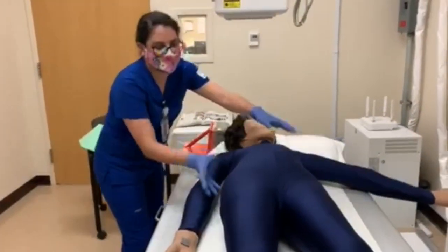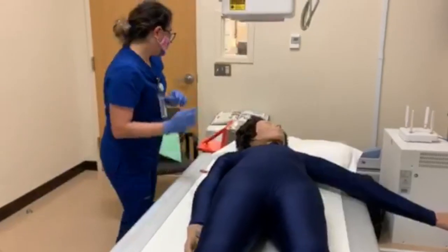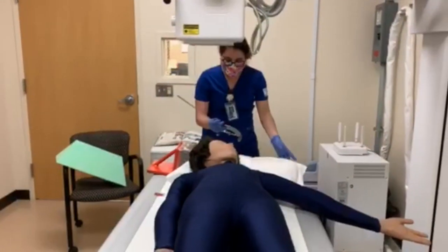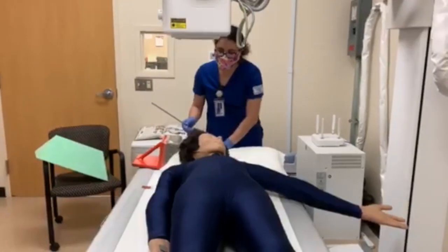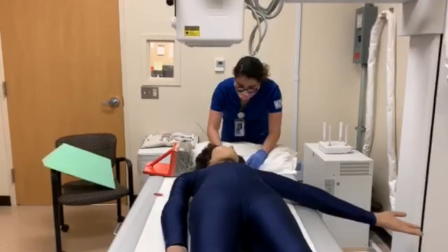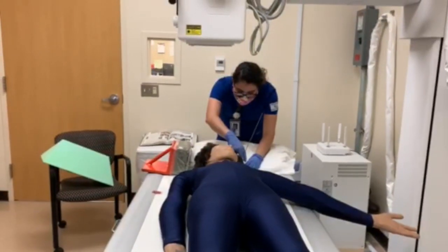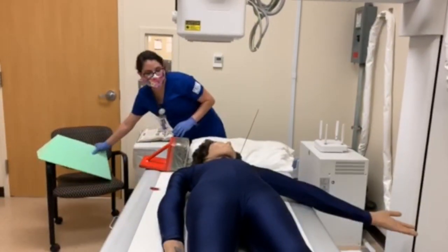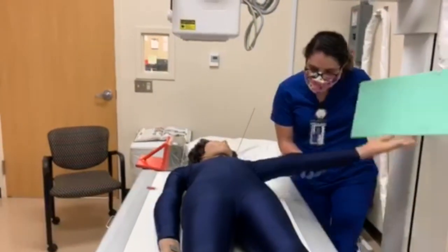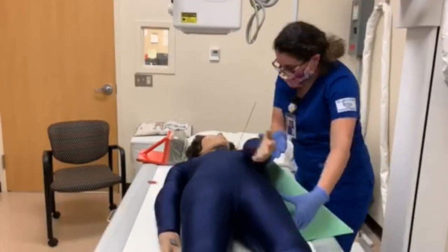We're going to move the center of the table. I'm going to use my angulator again to get her a 20-degree angle from 90, or from true lateral. I'm going to use a sponge back here to prop her up.